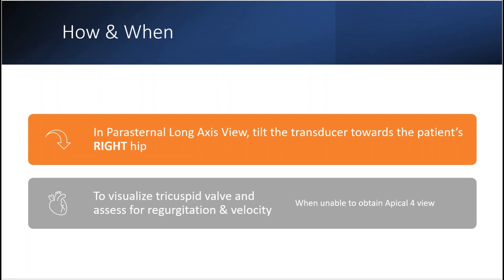To obtain the RV inflow view, first you get the parasternal long axis view and then you tilt the transducer towards the patient's right hip. The RV inflow view is indicated when you want to visualize the tricuspid valve and to assess for tricuspid regurgitation and its velocity. This is especially needed when one is unable to obtain an apical four view due to the patient having poor windows.